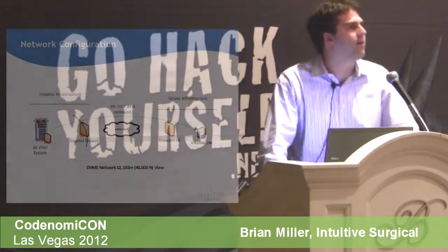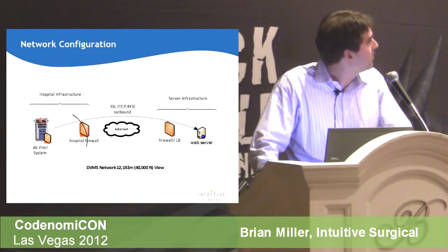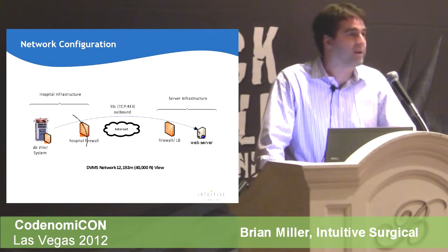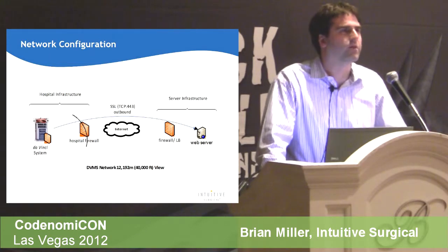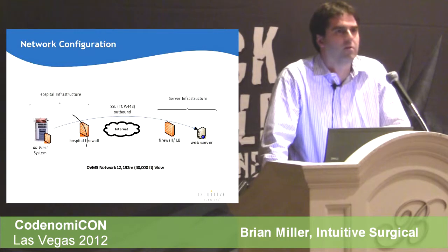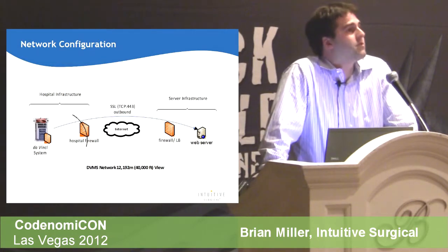So just a quick overview of how we got into realizing that fuzzing was something that we needed to bring into our testing scheme. We had our systems in our remote servicing application, where we were just finding that they would drop off the grid, and they typically communicate up at some periodic duration. We were noticing that some of them weren't communicating, and the way that it was being resolved is we'd get one of our field engineers, they'd go and they would just power cycle the system and it'd start working. And so we were trying to understand what that was.